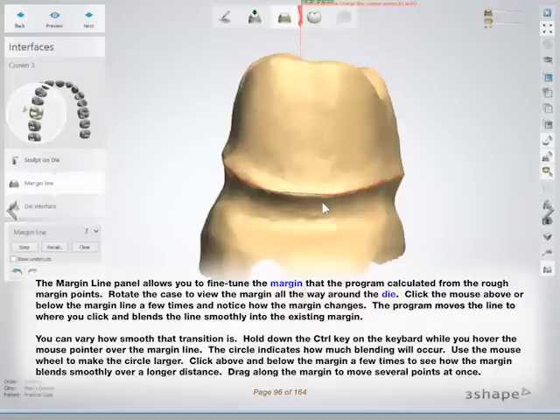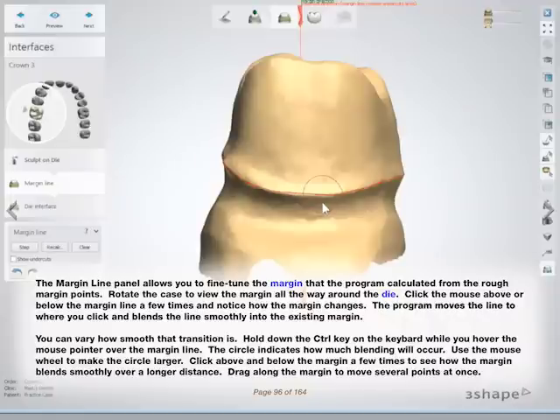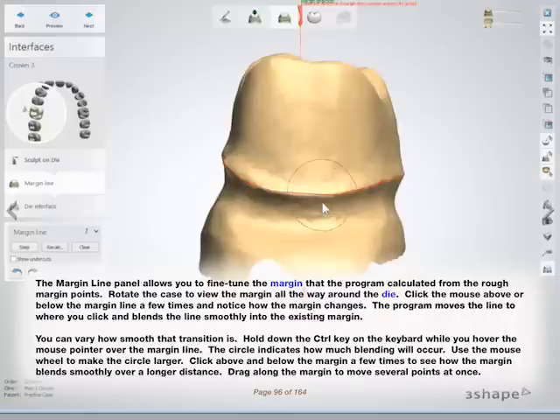You can vary how smooth that transition is. Hold down the control key on the keyboard while you hover the mouse pointer over the margin line. The circle indicates how much blending will occur. Use the mouse wheel to make the circle larger. Click above and below the margin a few times to see how the margin blends smoothly over a longer distance. Drag along the margin to move several points at once.